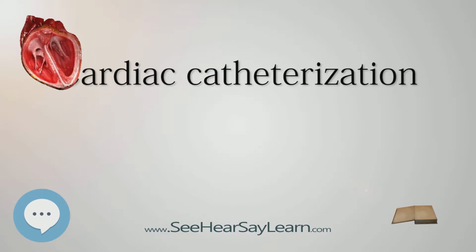Left heart catheterization allows for direct intervention in cases of coronary artery occlusion. This technique is also used to assess the amount of occlusion, or blockage, in a coronary artery, often described as a percentage of occlusion. A thin, flexible wire is inserted into either the femoral artery or the radial artery and threaded toward the heart until it is in the ascending aorta. Radial access is not associated with an increased risk of stroke over femoral access. At this point, a catheter is guided over the wire into the ascending aorta, where it can be maneuvered into the coronary arteries through the coronary ostia.